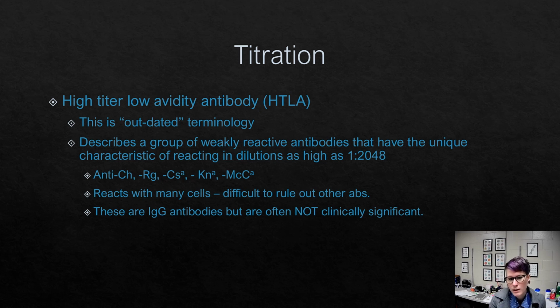Sometimes titers are performed on what we call high titer, low avidity antibodies. This term isn't really used anymore, but there is a group of antibodies that have a very high titer but low avidity. So usually these are not clinically significant antibodies.